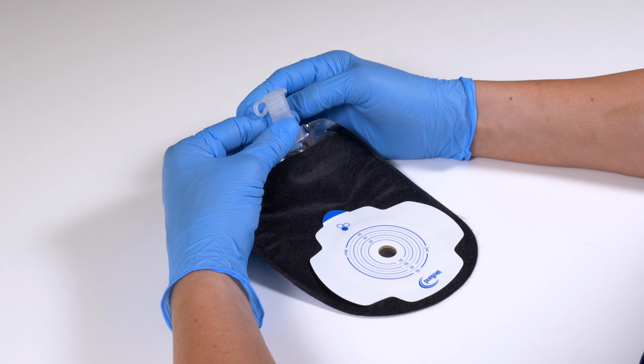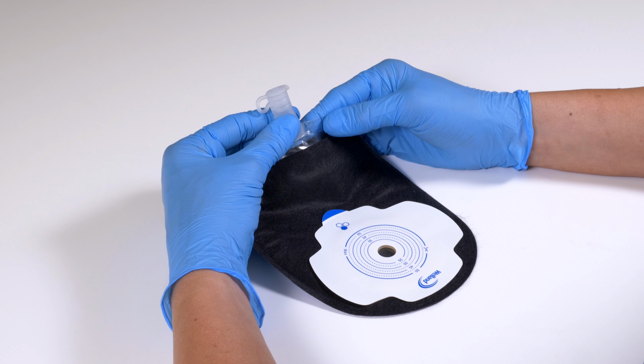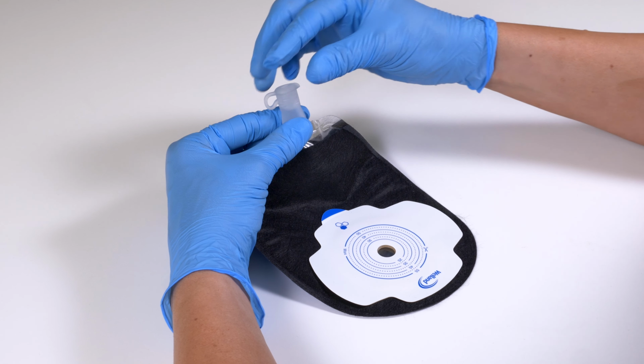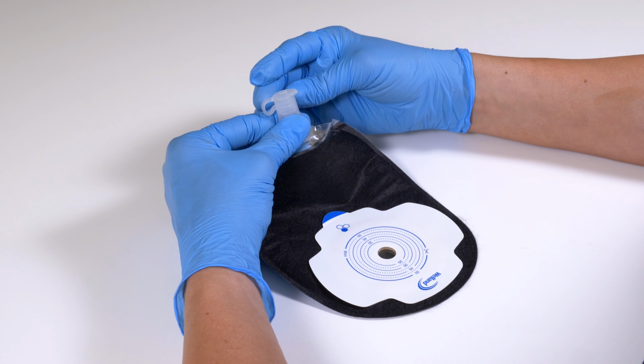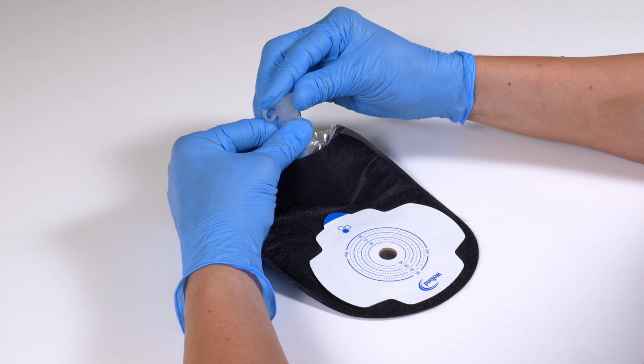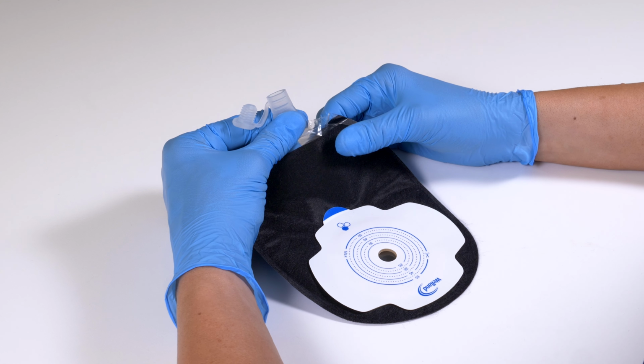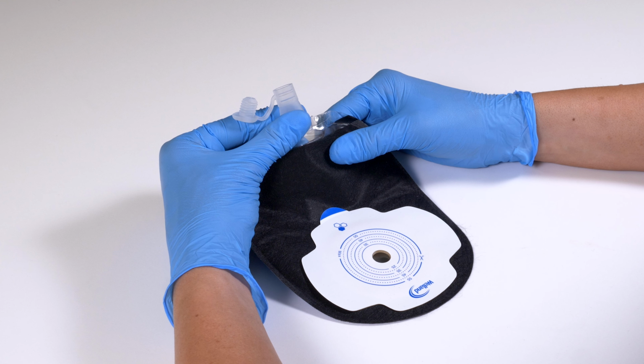If you use a urostomy pouch with a bung tap, stand or sit near the toilet. Turn the outlet tap upwards and gently squeeze behind the tap to control the flow. Then unplug the tap and direct it towards the toilet, loosening your grip to allow urine to drain into the toilet, keeping hold of the tap to aim the flow.